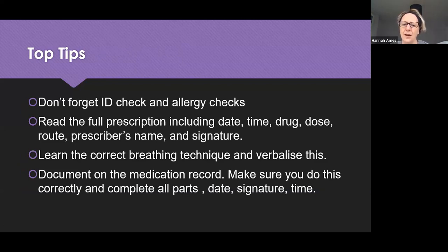Okay, verbalise your medication matches your drug chart when you get it out of your trolley. Okay, verbalise the expiry date and verbalise how many puffs you are going to give. Okay, learn the correct breathing technique, so either single breath or multi-breath. Okay, and you must verbalise that technique correctly. Okay, and make sure you document on the medication record. Okay, make sure you complete all parts. Okay, so check for a signature, a date and a time.